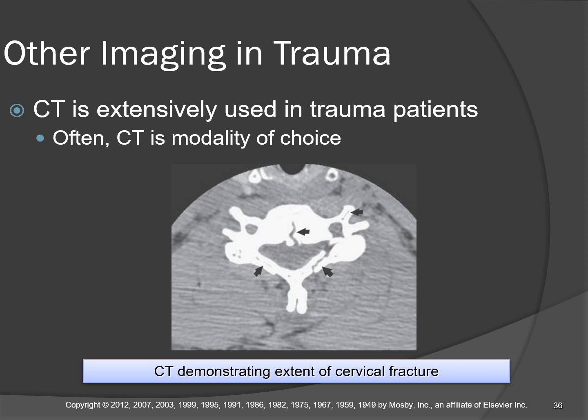Well, an ankle, no. You can diagnose a fractured ankle with plain films still. Fractured elbow, yeah, still plain films. Fractured hip, yeah, you can diagnose with plain films, but you get a much better idea of what's going on with a CT scan of the pelvis.